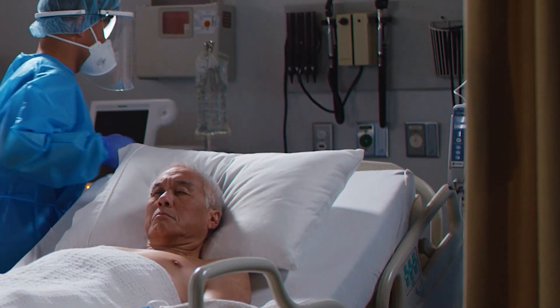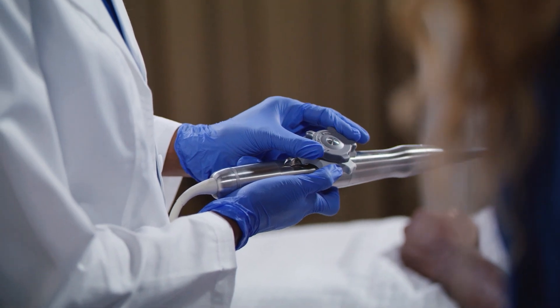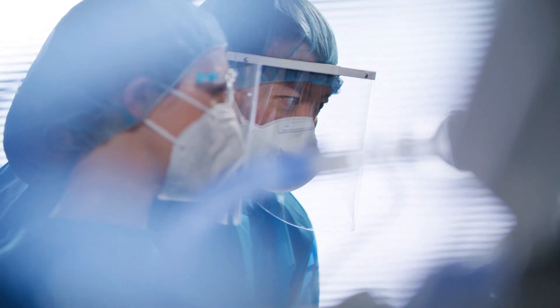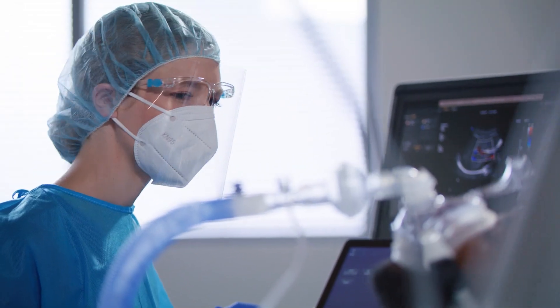Teams are challenged by workloads, mixed levels of seniority, and overall system form factors. Technology can be overwhelming and complicated, particularly with high staff turnover and in complex patient management.